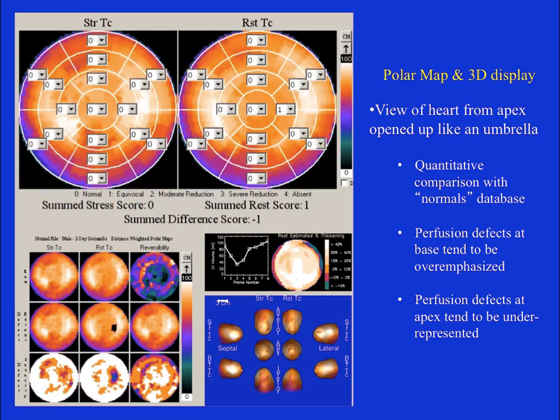This is a little bit of detail about the quantification. I will not go much into the details, but simply it is showing that we can quantify even the myocardial thickness, and we can also quantify the amount of myocardium jeopardized due to the stenosis in terms of surface area of the ventricle, or in terms of percentage of the area affected in a particular arterial territory. And we can also quantify how many grams of the myocardium has been jeopardized.